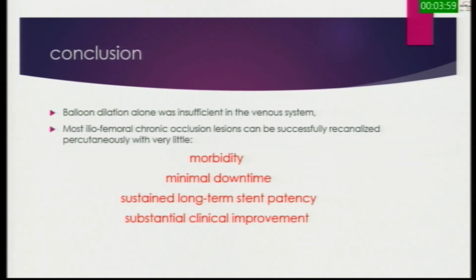Finally, we concluded that balloon dilatation alone was insufficient in the venous system. Most iliofemoral chronic occlusion lesions could be successfully recanalized percutaneously with very little morbidity, minimal downtime, sustained long-term stent patency, and substantial clinical improvement. Thank you.